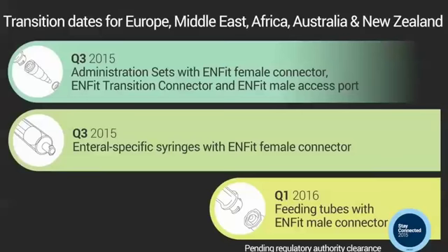Anticipated timing for the introduction of these new connectors in Europe and other markets throughout the world will be administration sets and enteral-specific syringes in the third quarter of 2015 and feeding tubes in the first quarter of 2016.